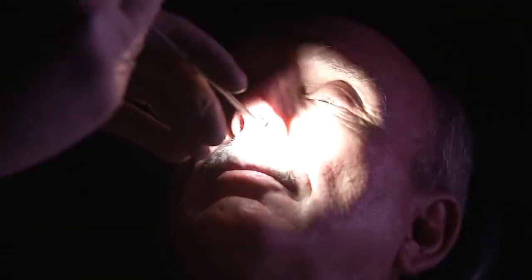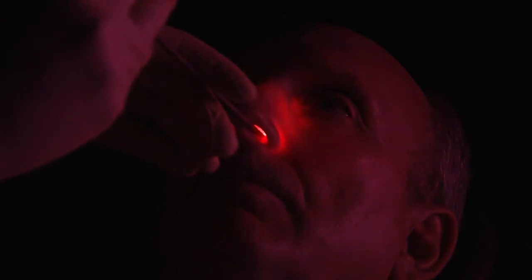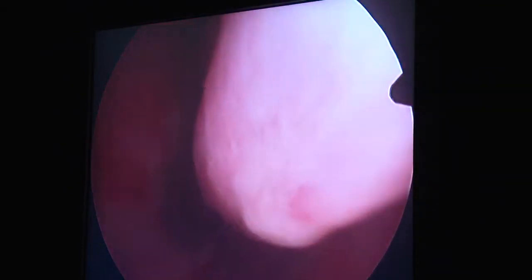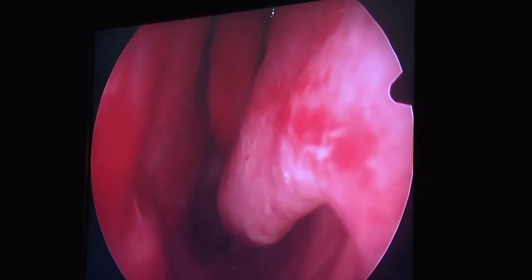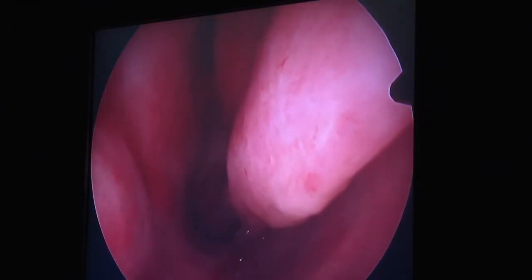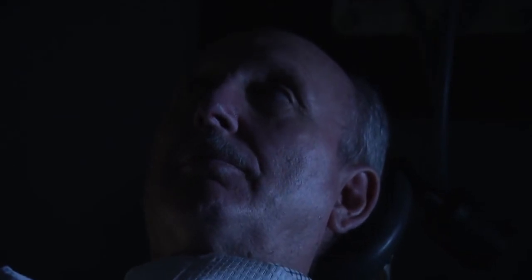The next portion of the surgery is shrinking what's called the turbinate, which runs along the floor on each side of your nose — it's this pink tissue showing on the screen. It has shrunk at this point because of the medicine we used to numb you up before the procedure, but as you can see, it runs the whole way from the front of the nose to the back. We're going to use a technology that causes scar tissue to form inside that tissue, causing it to shrink on itself. I pretty much expect you to feel nothing — some people feel a little warmth or a slight shock-type feeling, but it's very mild. Each time I place it in the tissue I'll say 'here we go,' step on the pedal, and count 10 seconds in my head. If you don't like the way it feels, tell me and I'll stop immediately.